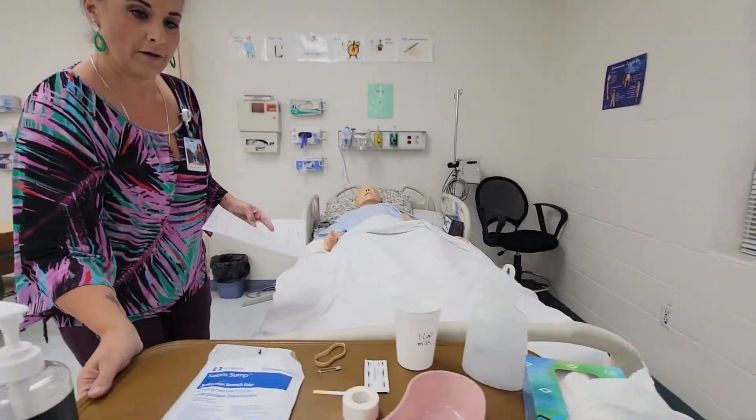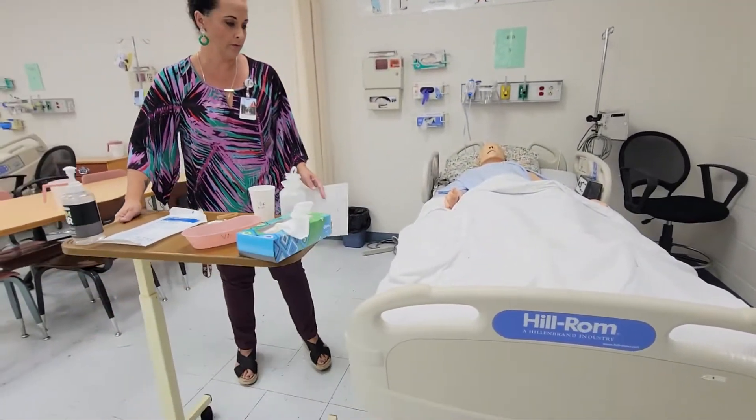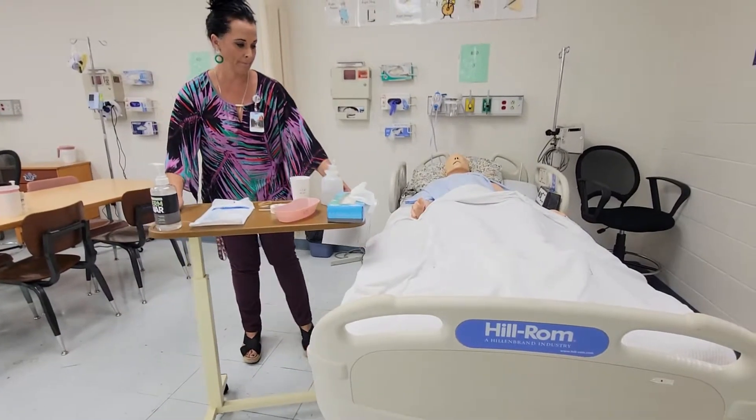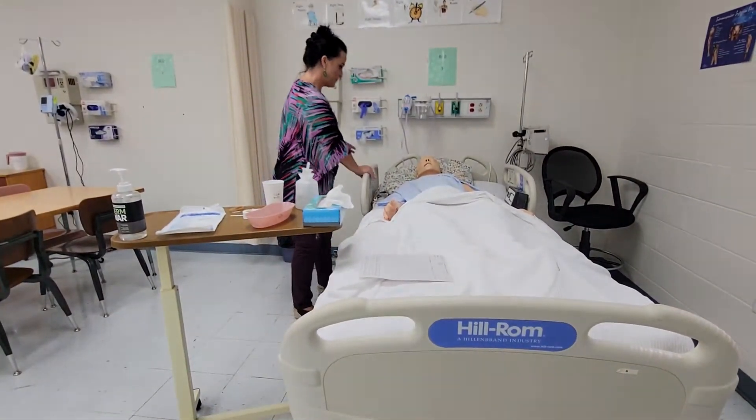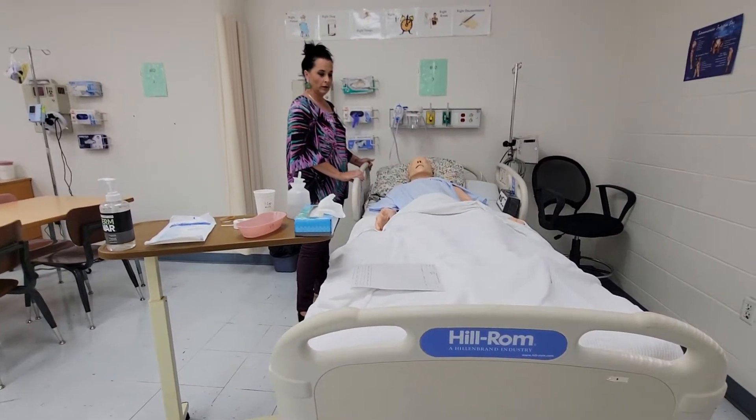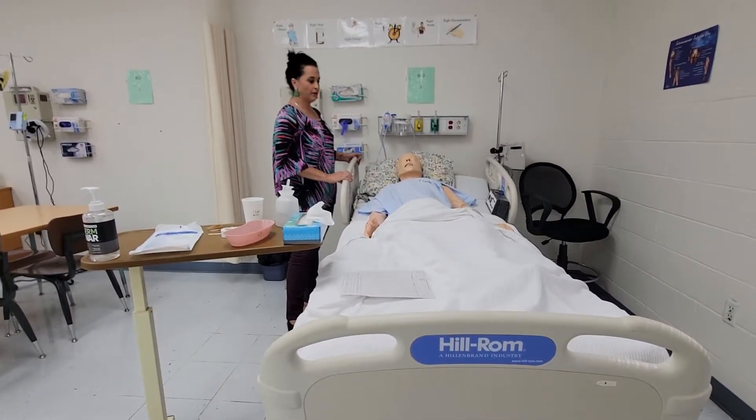I'm going to move the bed table over here and set the orders down. I'm going to go ahead and sit you up — you want to do at least a 30-degree angle.